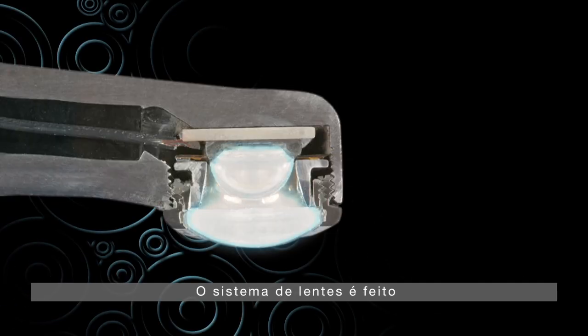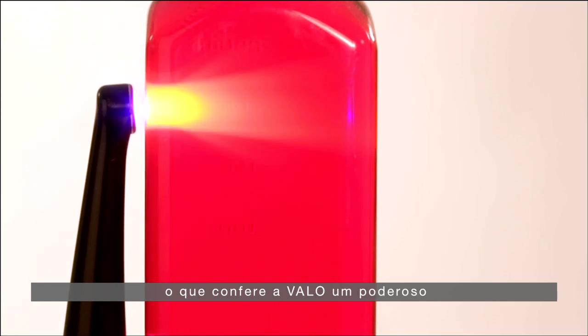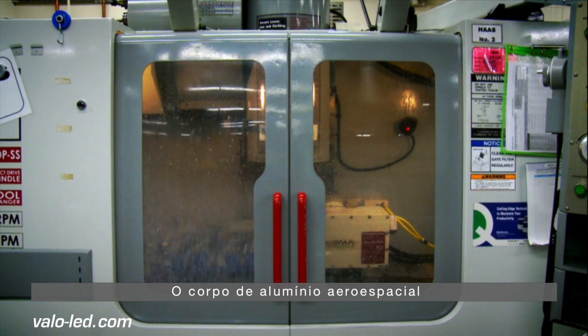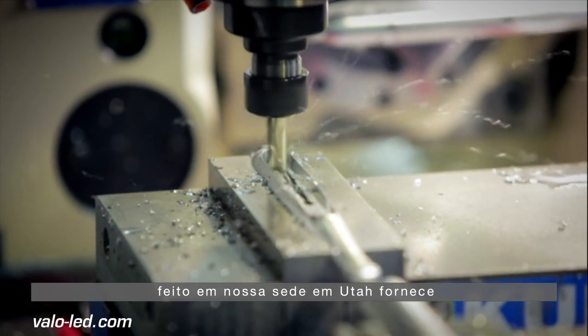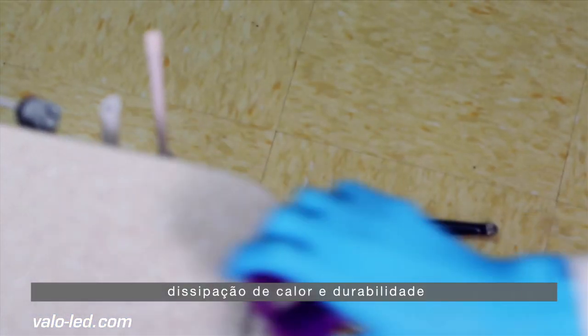The lens system is made up of glass and rhodium plating, which is what gives VALO the intense beam of light even at a distance. The aerospace aluminum body is machined in our facility in Utah, and it provides excellent heat dissipation and unparalleled durability.